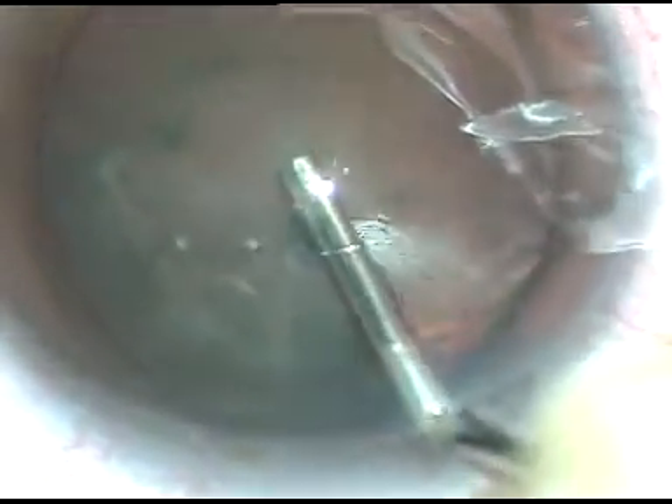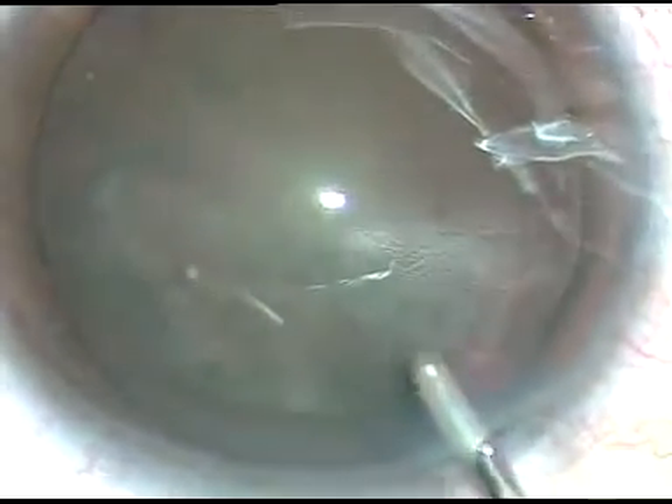I have started the case. This is a very soft cataract. The patient is a very young lady, 42 years old. The cataract is soft and the nucleus is very soft.